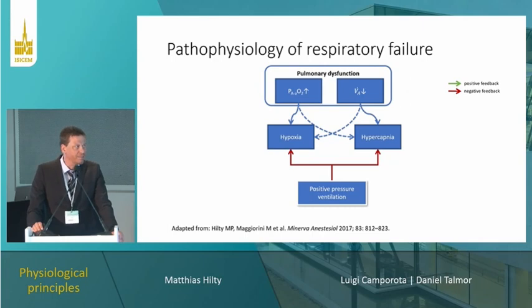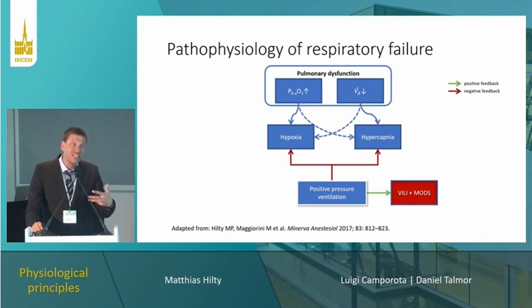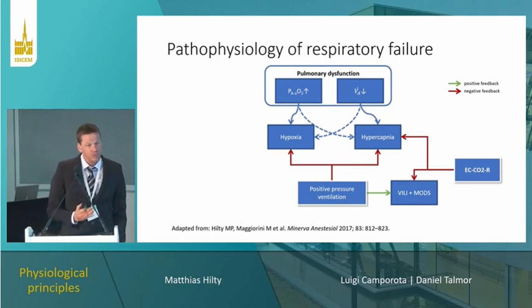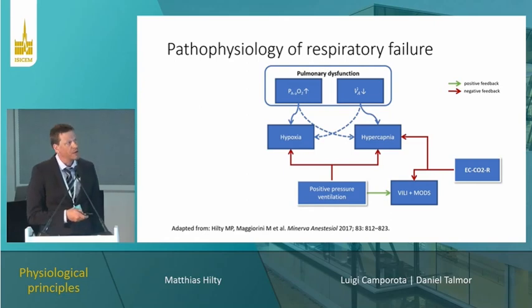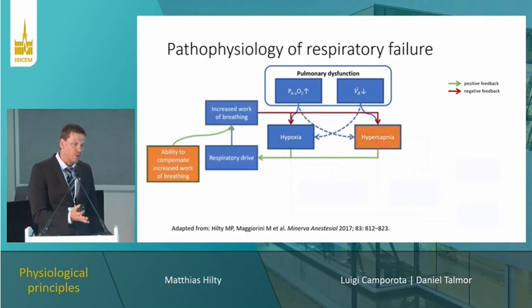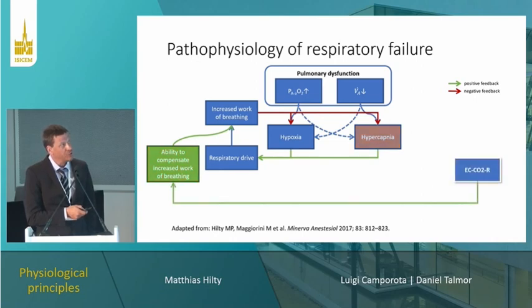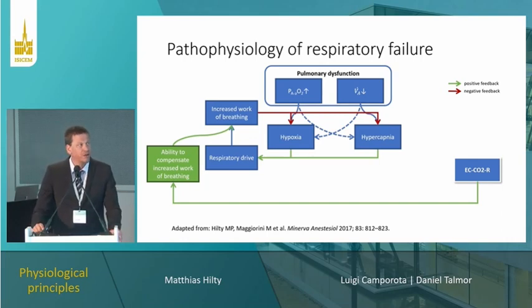So we do have now this possibility to go back to our patient with respiratory failure that we have intubated, that we make the lung take over this increased mechanical stress to counteract hypercapnic respiratory failure. And then, of course, we can induce ECCO2R, extracorporeal CO2 removal, and decrease the amount of work that we have to do with the respirator and decrease the risk of ventilator-induced lung injury. Going back one step, if you remember, the patient developed hypercapnic respiratory failure when breathing spontaneously. And I hinted at this, of course, we could at this point induce ECCO2R and recompensate this patient's ability to do the work of breathing that is needed, because we take over 50% of the VCO2 in this patient by ECCO2R.